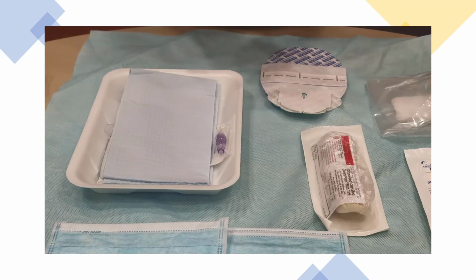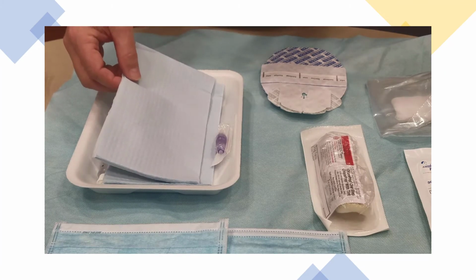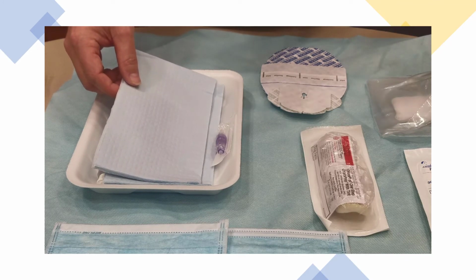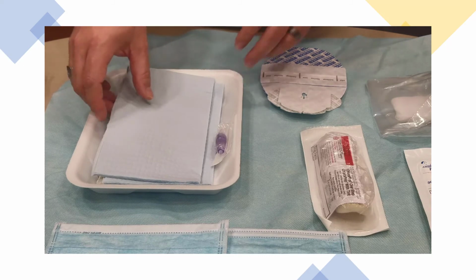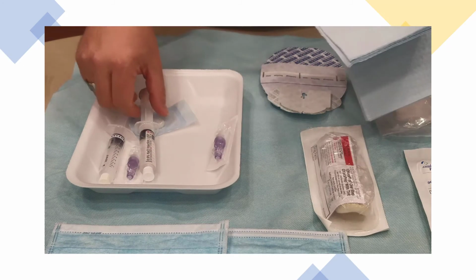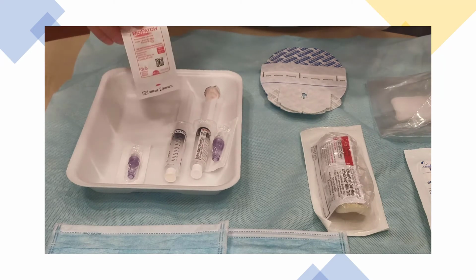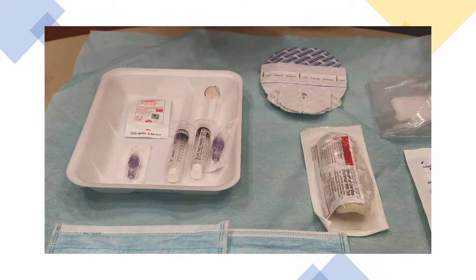Remember that this is a sterile procedure, so we want to make sure that we are accessing the device with masks on, so that if I sneeze or if the patient sneezes or if we cough or anything, we're not getting anything on the site. You have your drapes, you have 2 saline syringes, and you have your BioPatch.